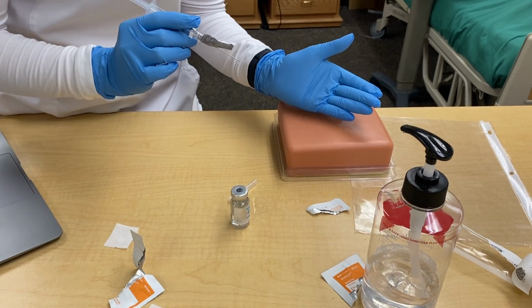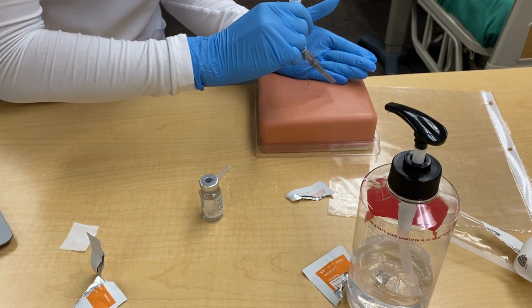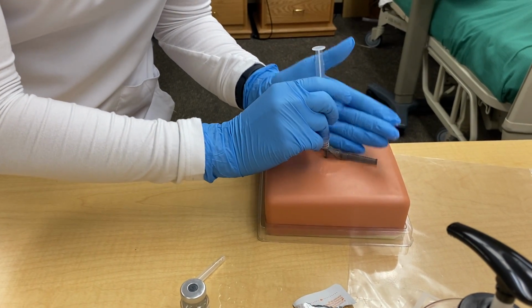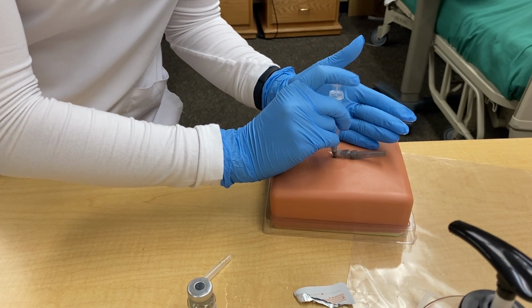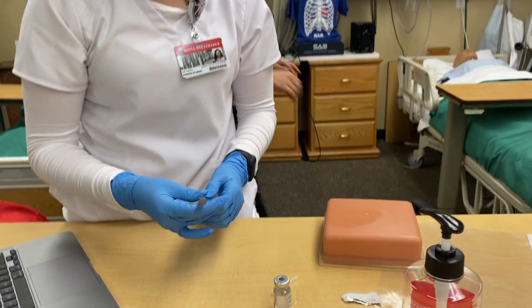I'm going to stretch the skin with this hand. As I'm stretching, I give. This one is going to be at a 90 degree angle. As I'm stretching, I automatically give. I stretch and I give, so this has to be kind of quick. And then when I let go of the skin with this hand, I have to let this go. And then safety.